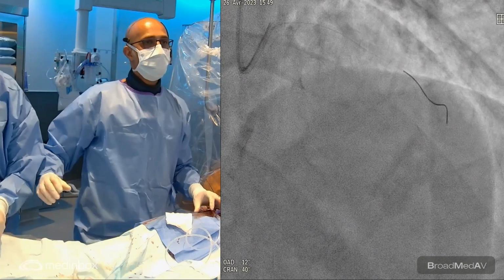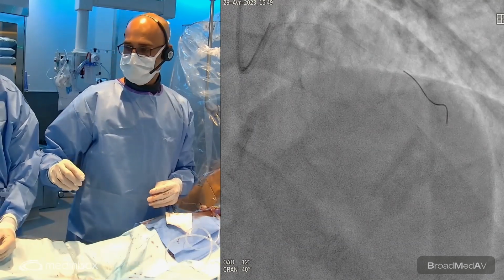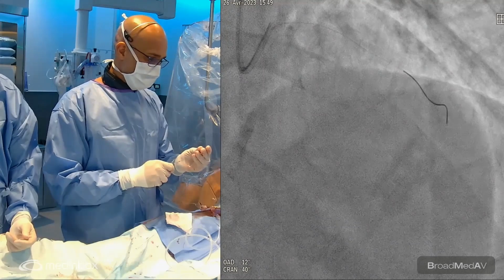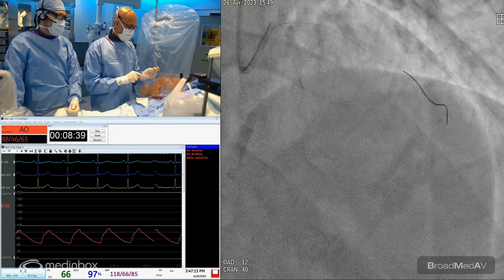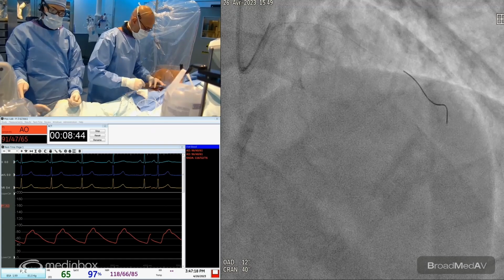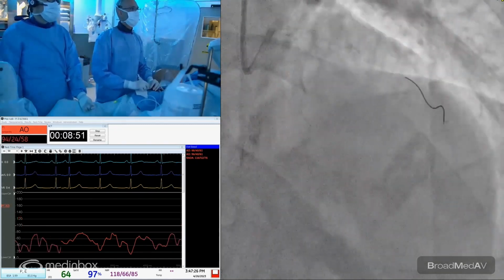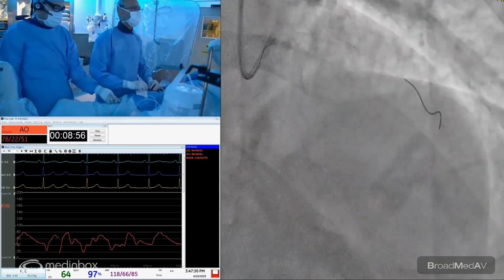So for sure, in terms of complexity of handling the distal main with atherectomy and the calcified circumflex, it will be a challenge. But I'm very curious to see the IVUS images.